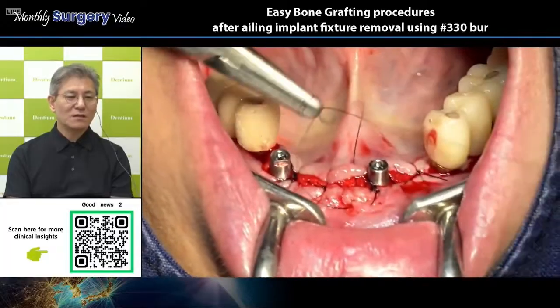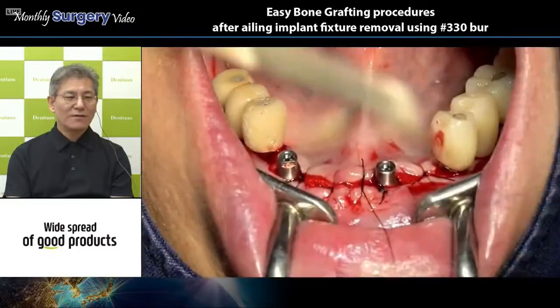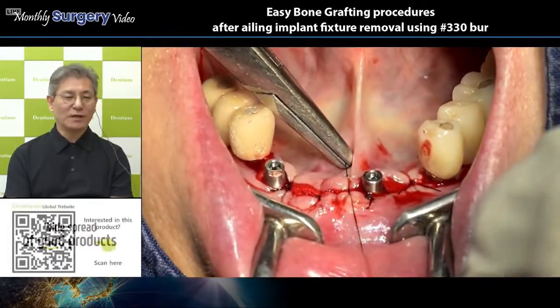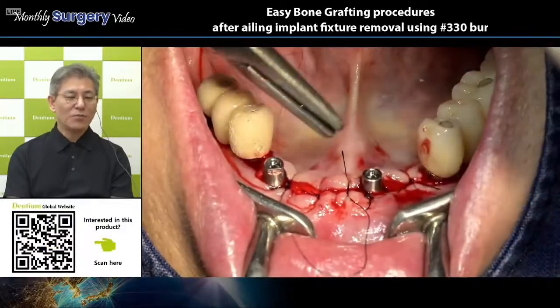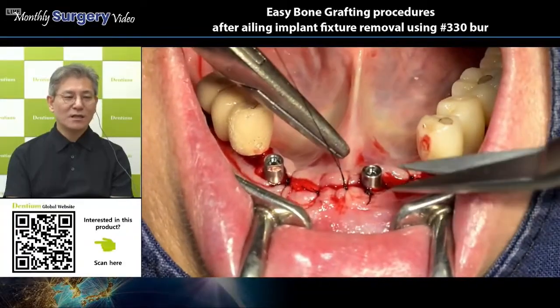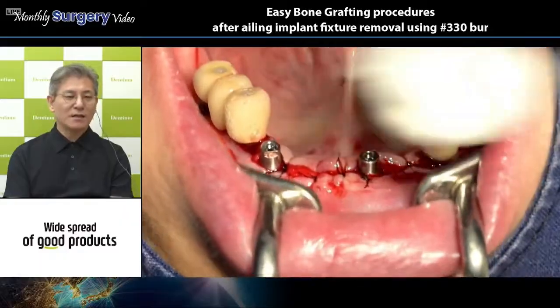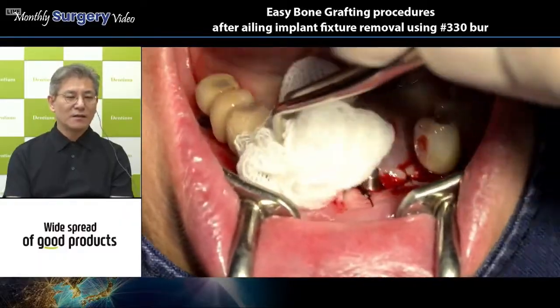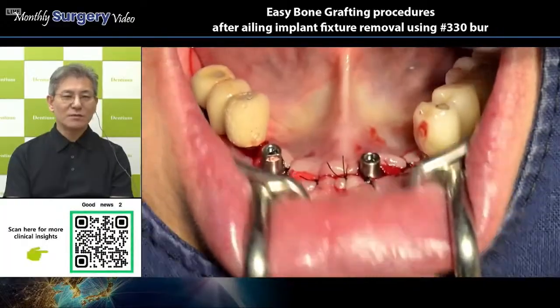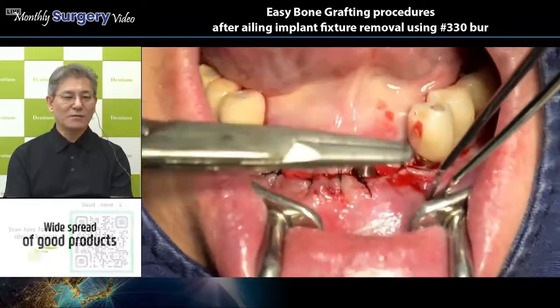So Dr. Chung is going to do a scan for this patient after 2 weeks, at the time point of stitch out, make a scan and take the file, and then make a temporary prosthesis procedure. A prosthesis will be applied for this patient.